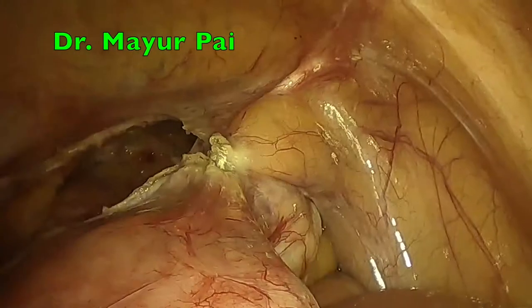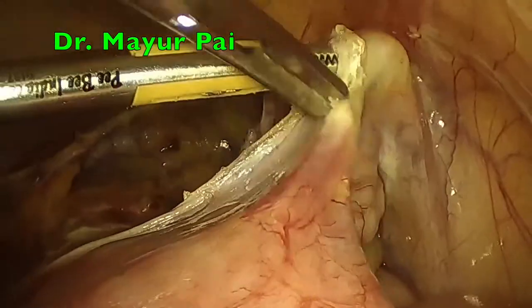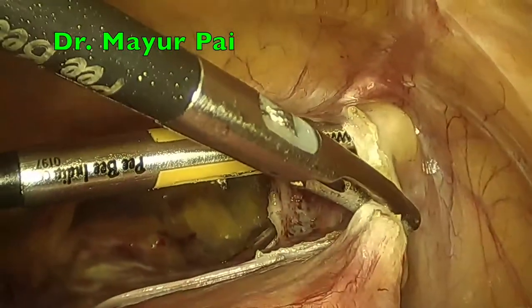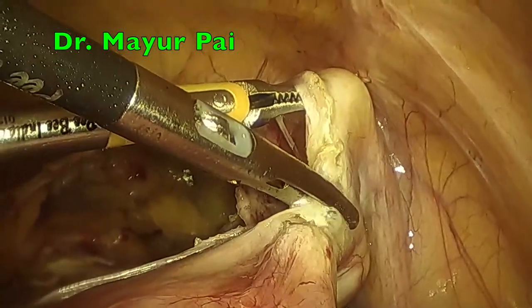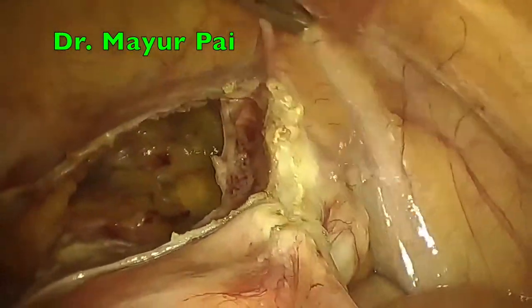The case was previously operated for an unknown reason on the right side, where the fallopian tube seems to have been removed. However, due to absence of any discharge card and lack of history from the patient's side, because she doesn't remember why it was removed, maybe there are more number of adhesions on this side.